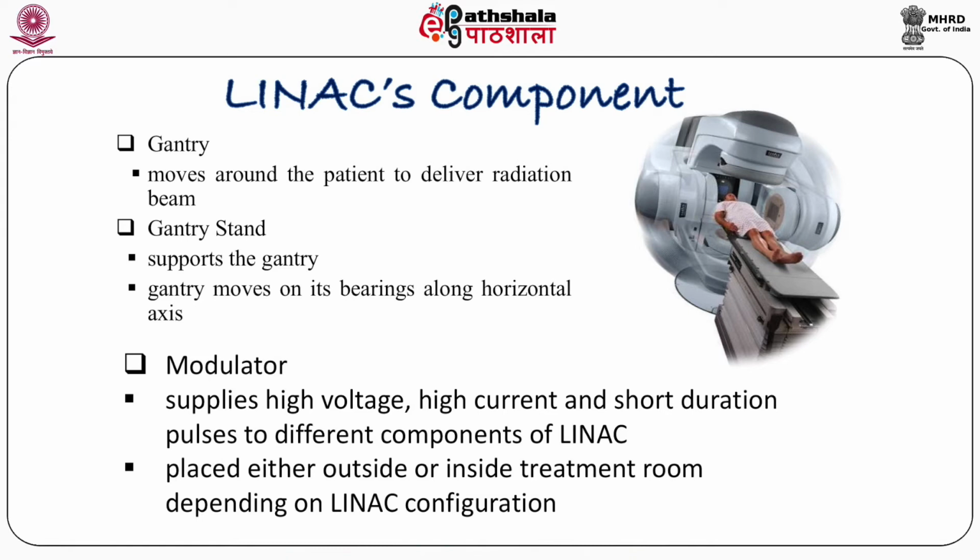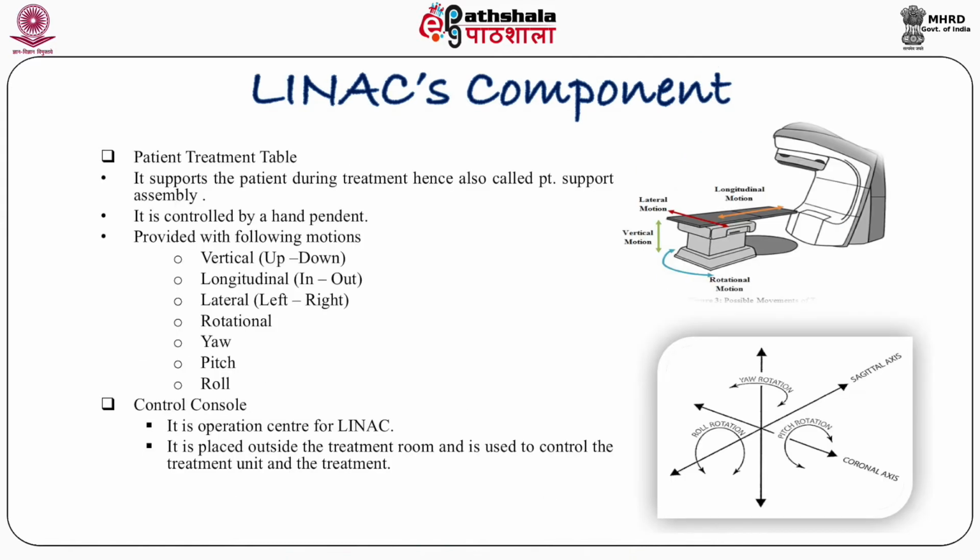Modulator. The modulator supplies high voltage, high current, and short duration pulses to different components of the linear accelerator, placed either outside or inside the treatment room, depending on LINAC configuration. Then the patient treatment table, which has many movements. It supports the patient during treatment.